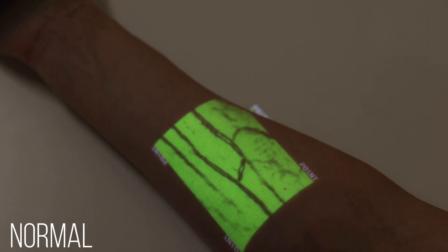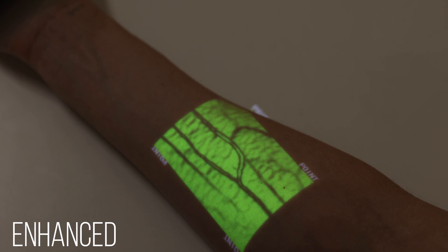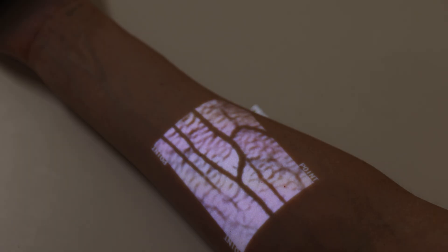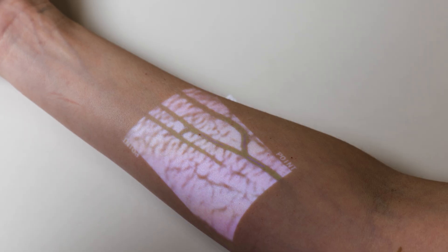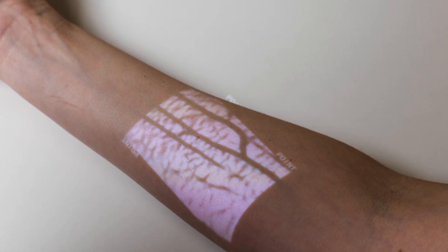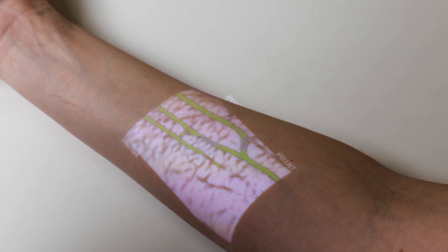The depth mode displays three different depths: deep, medium, and shallow. Green means the blood vessel is 6 to 8 millimeters underneath the skin; blue means 4 to 6 millimeters; and red means 2 to 4 millimeters. The depth mode should only be used as a reference and should not replace ultrasound techniques intended for deeper veins.